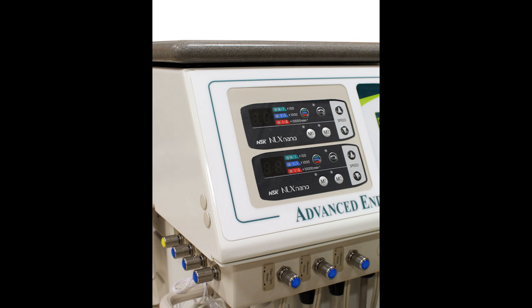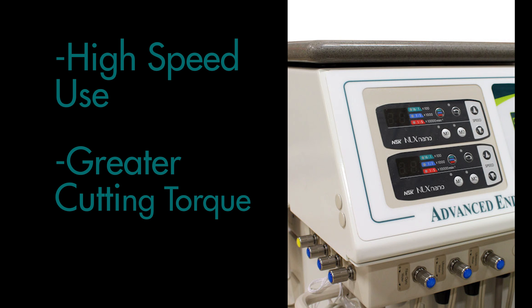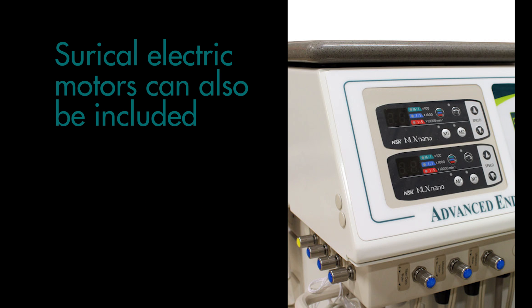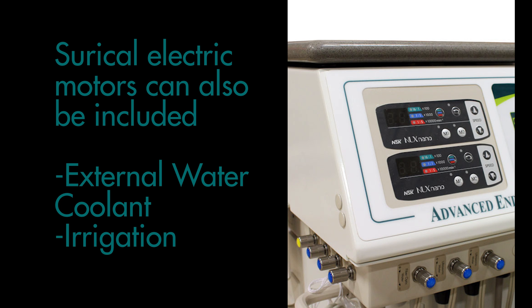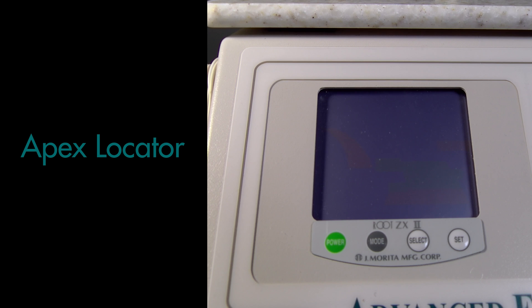The system is shown with electric motors for high-speed use that provide greater cutting torque to either supplement or replace air-driven handpieces. Surgical electric motors can also be included along with external water coolant and irrigation. An endodontic torque-controlled rotary motor is also shown equipped with the system along with the Root ZX apex locator.